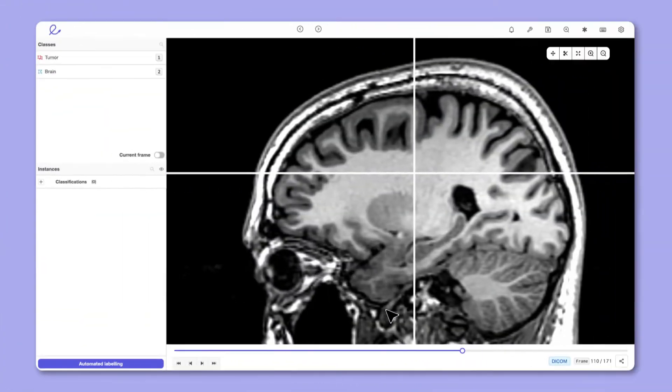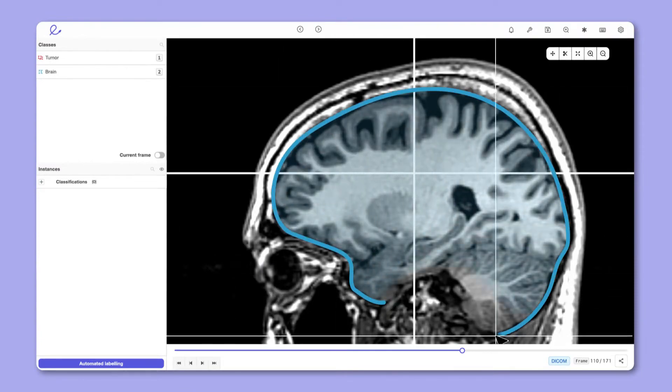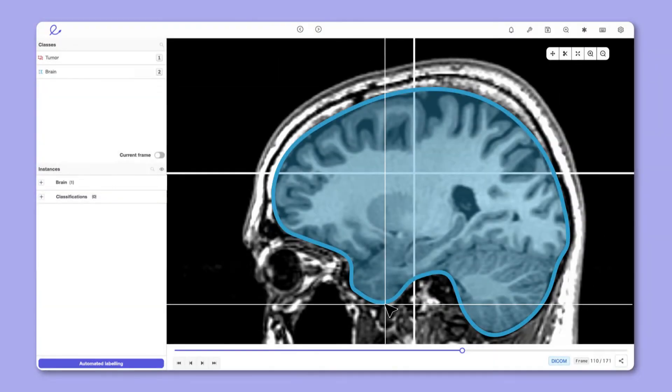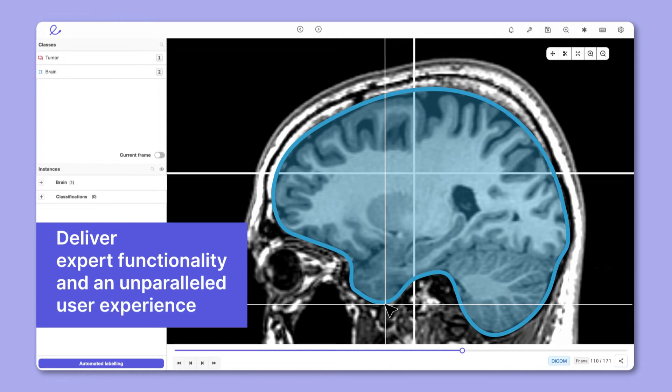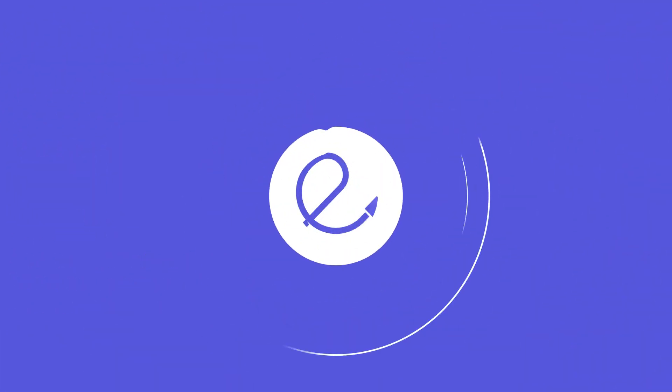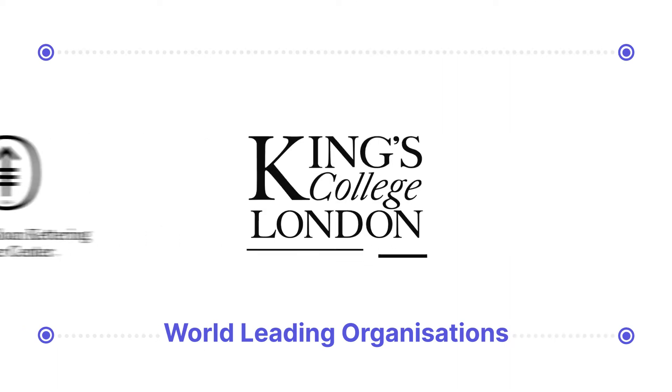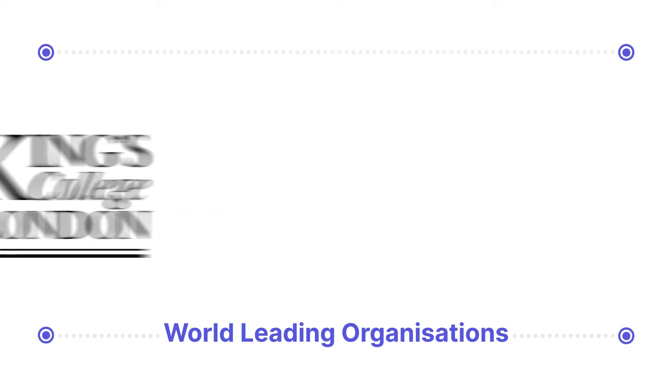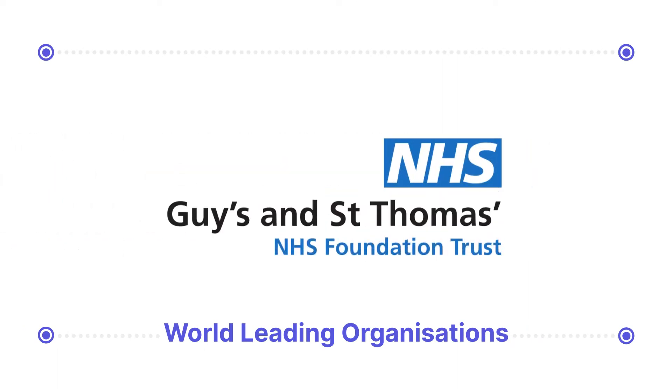It has been developed in close collaboration with clinicians and healthcare data science experts to deliver expert functionality and an unparalleled user experience. Encore's software empowers some of the world's leading organizations building computer vision models for medical imaging.